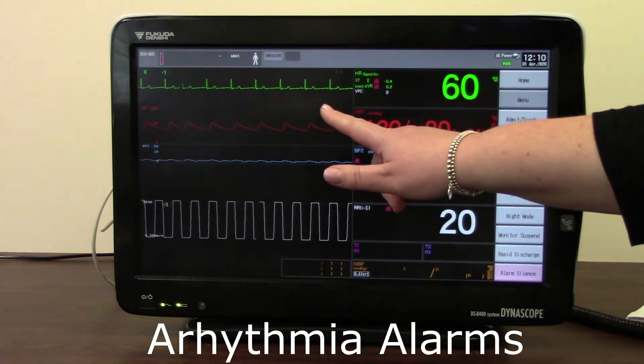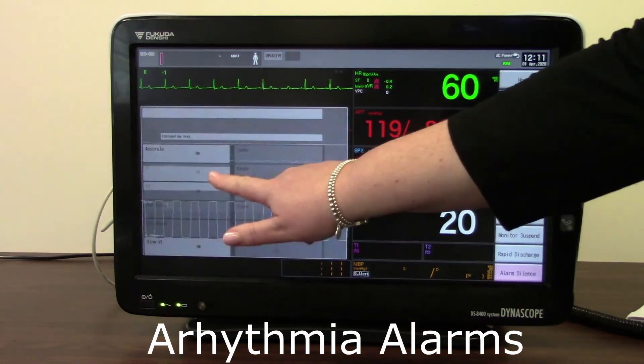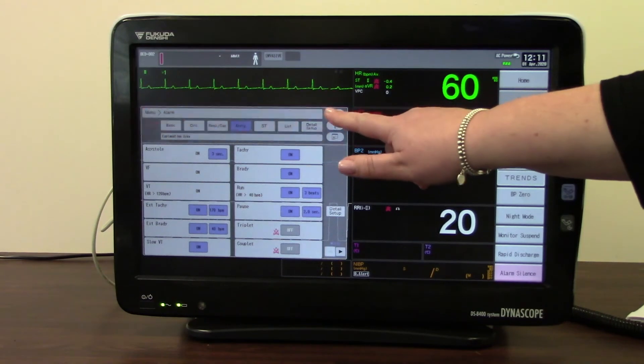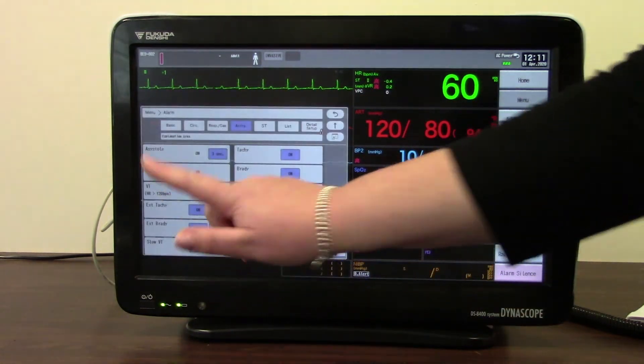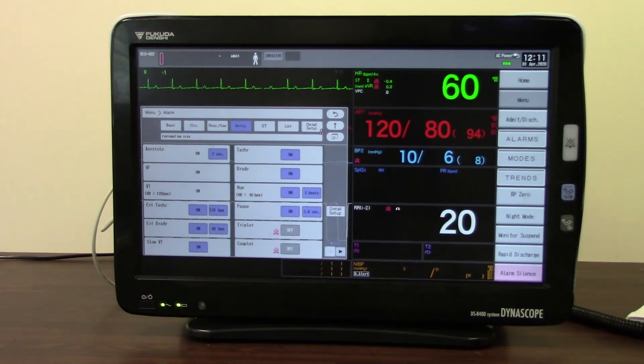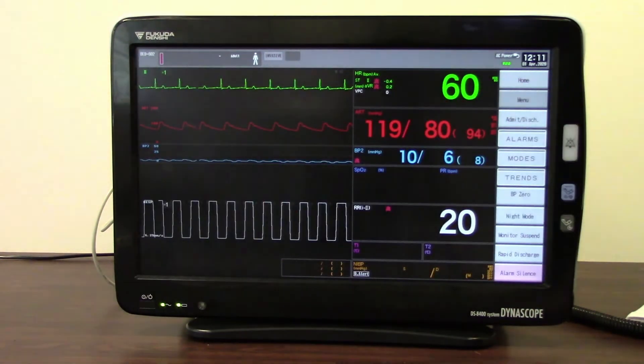The other ways I can reach my arrhythmia alarms are via the menu, and also by going back into the heart rate parameter. So there are three different ways to get to alarm settings and to set arrhythmia and upper and lower alarm limits.